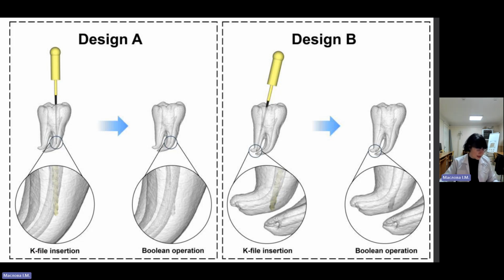In the last decades, it has become common practice to use an operating microscope during the various phases or stages of endodontic treatment. The microscope offers magnification, but almost as important, it gives excellent light directly through the lenses into the access cavity. That gives the operator tremendous advantages, especially in difficult cases. And in straight root canals, it is possible to observe the canal all the way to the apical foramen.